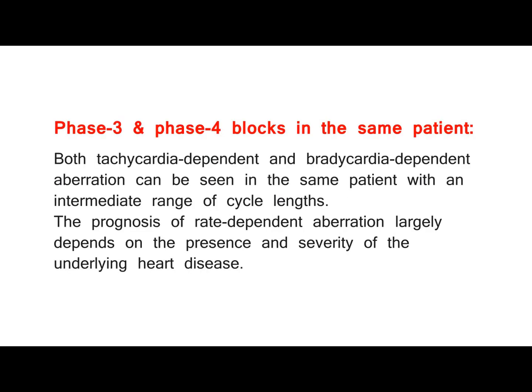Phase 3 and phase 4 blocks in the same patient. Both tachycardia-dependent and bradycardia-dependent aberration can be seen in the same patient with an intermediate range of cycle lengths. The prognosis of rate-dependent aberration largely depends on the presence and severity of the underlying heart disease.